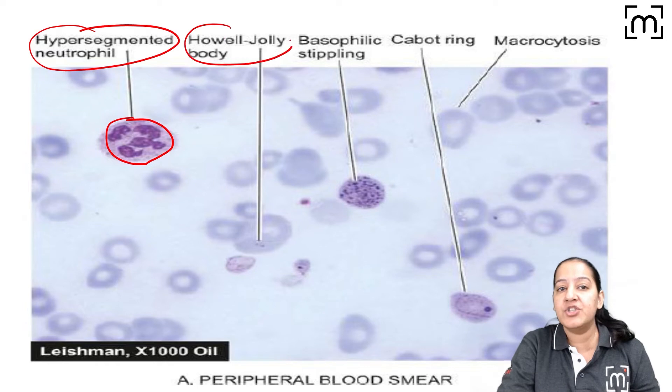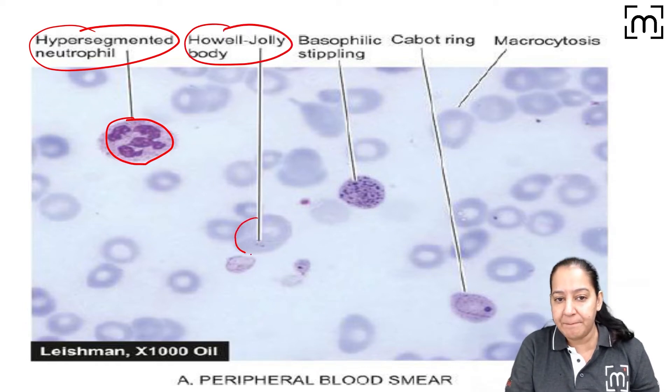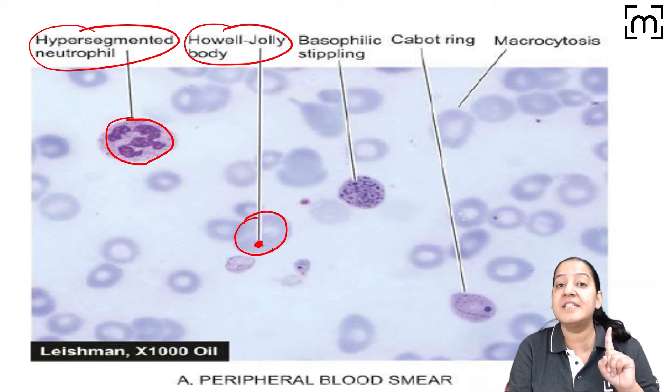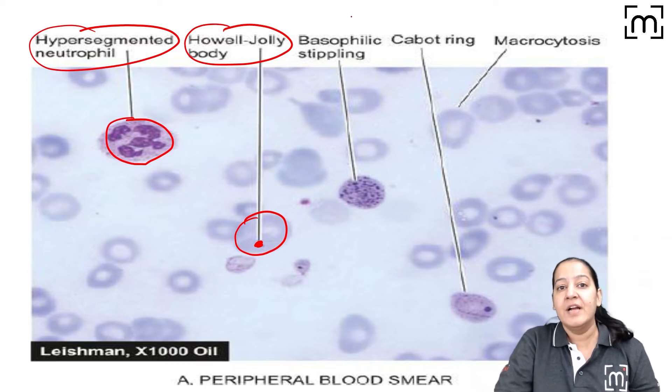The second is the Howell-Jolly Body. You can see it is a purple inclusion in the cytoplasm of the RBC and it is the DNA remnant.